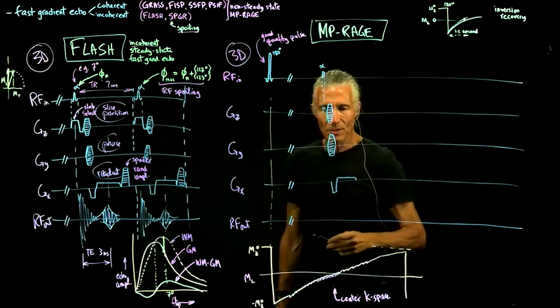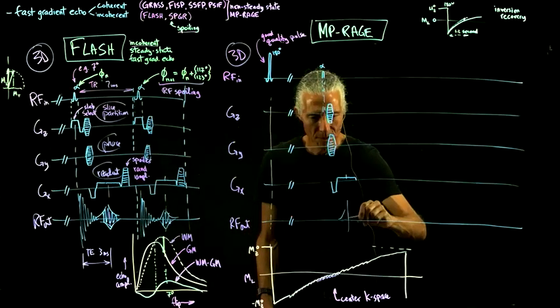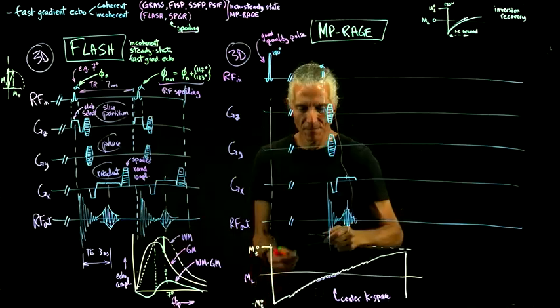And so what signal comes out? Well, here's our echo coming out, and here's the FID that we're not recording. So there's our echo.